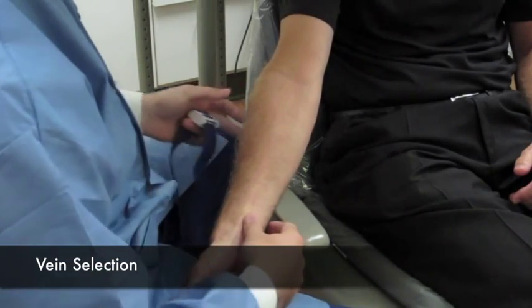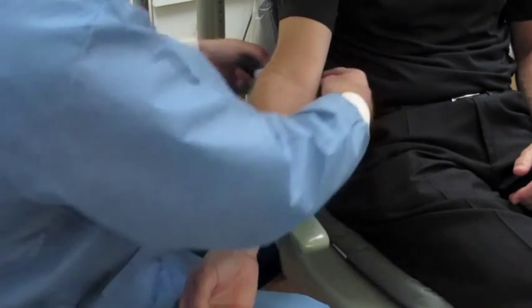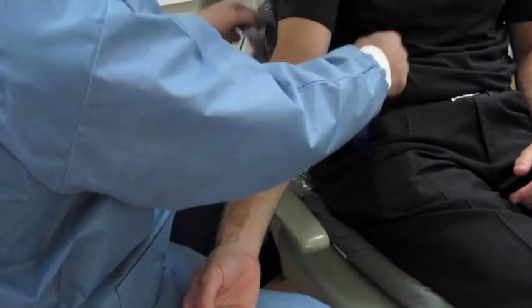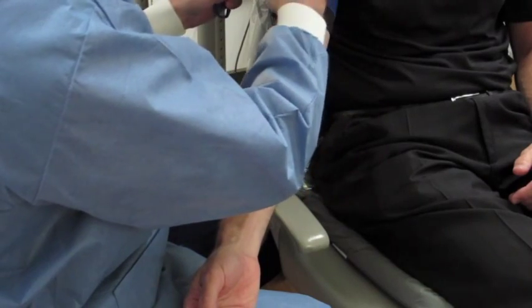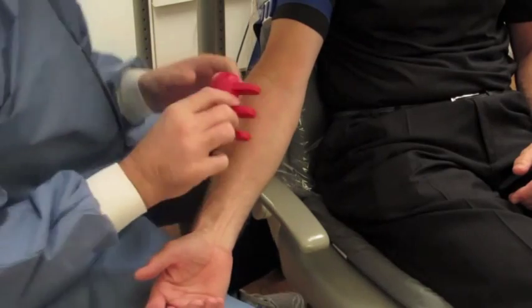The purpose of this video is to help with some of the finer points of blood draw. As we begin to look at the arm, we place the tourniquet — tight but not too tight — relative to about 40 millimeters of mercury.